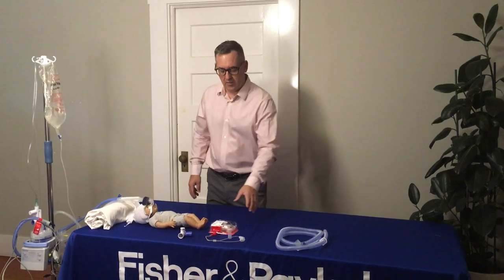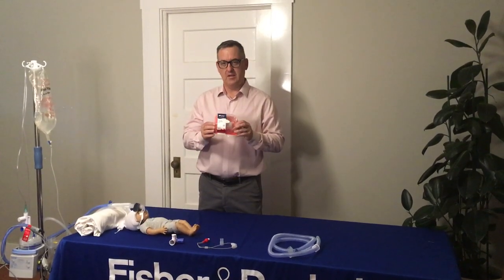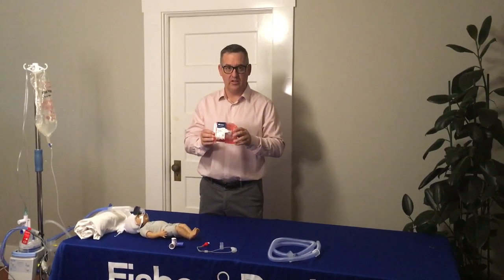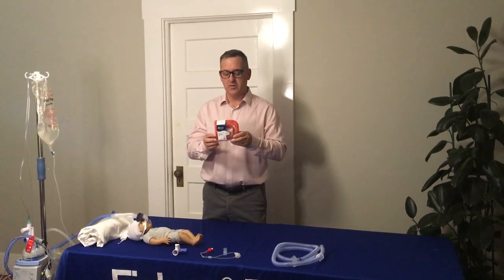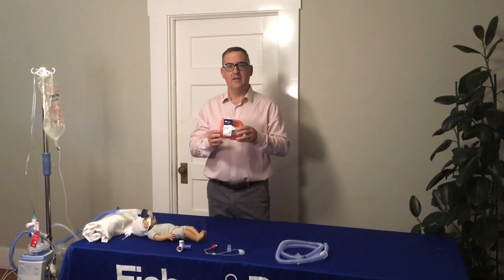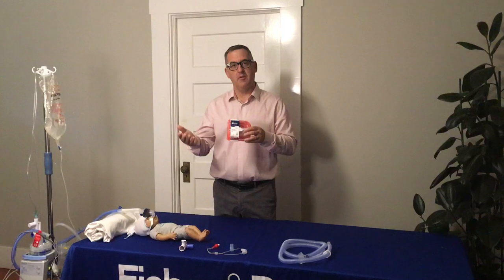Good morning. This is Ryan Selby and this is going to be a short two to three minute video on the new Fisher & Paykel bubble CPAP and nasal CPAP transition to high flow nasal cannula kit. I'm pretty excited about this particular product because what it's designed to do is eliminate all of the circuits hospitals tend to waste when they transition from bubble CPAP to high flow.